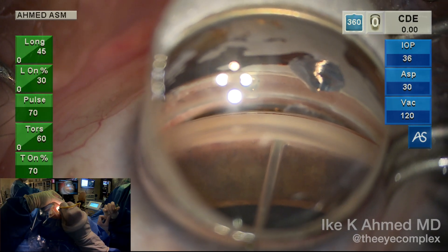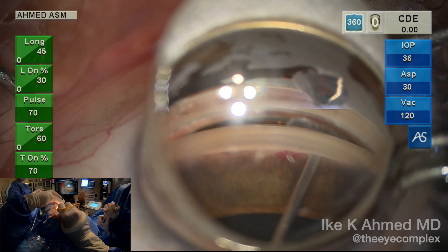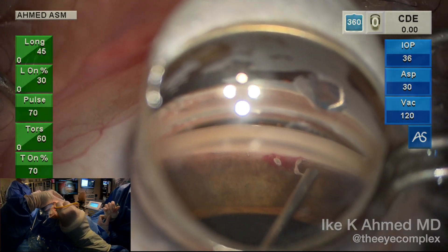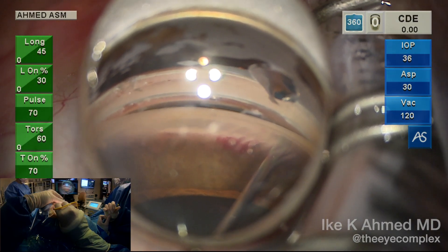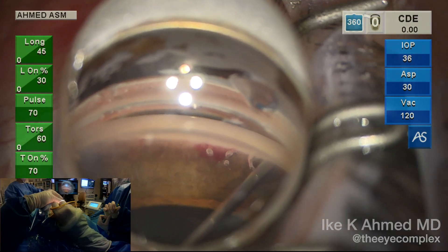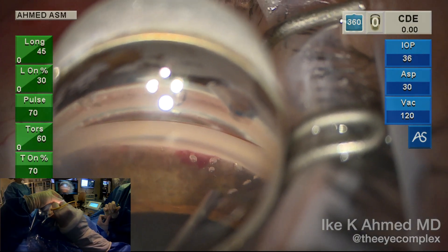Some gentle upward position, not pushing too hard, and we center the probe on the anterior border of the pigmented trabecular meshwork. This results in some nice openings directly into the trabecular meshwork. We change our grip a little bit as we go to the right — more of an overhand grip, as you can see.